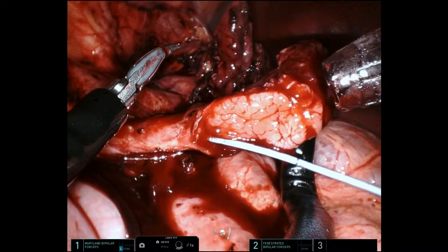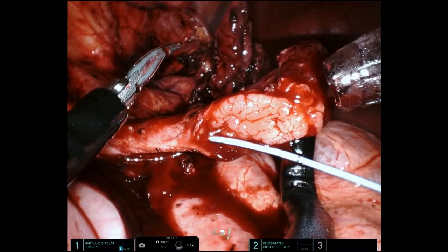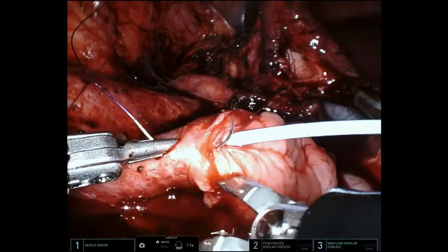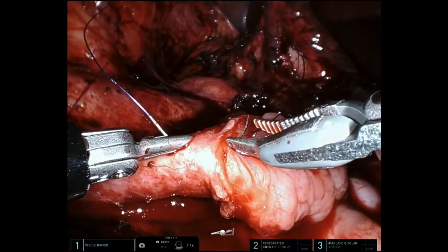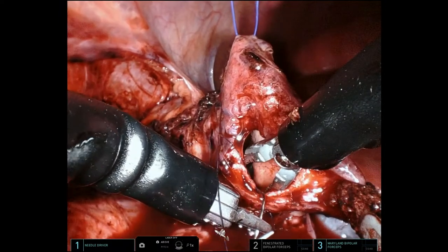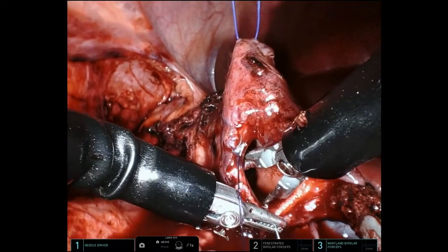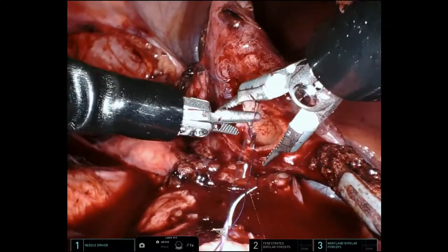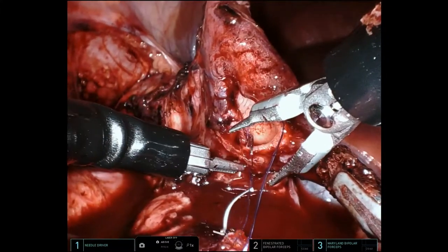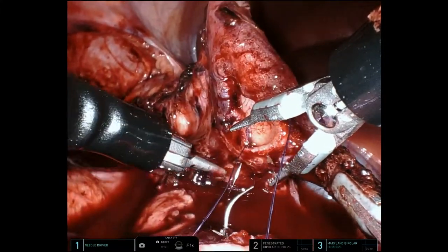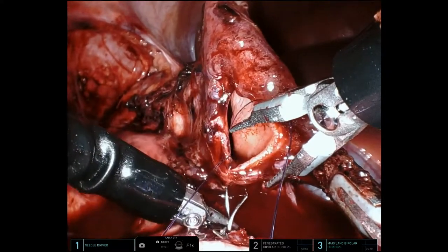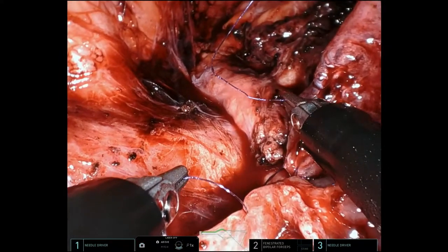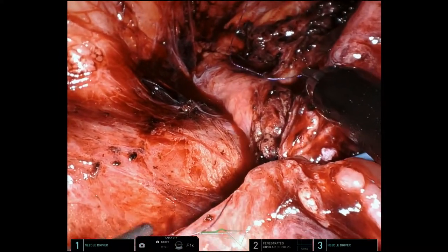This is just peristalsis. This is placement of the initial anastomotic sutures. In this case I'm using 5-0 absorbable suture — I usually use 6-0 Monocryl, but in this case I'm using 5-0 PDS. Given the inflammatory nature, I want to make sure that this suturing material lasts a little bit longer.